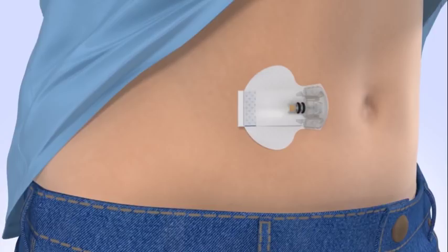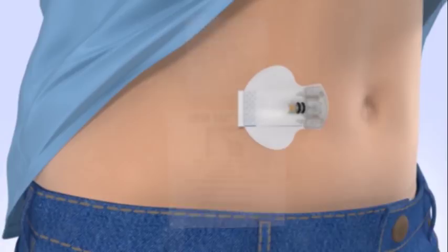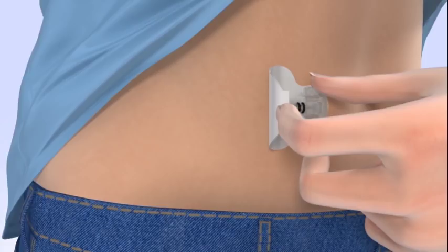Now that your sensor is inserted, you may wish to use an optional liquid adhesive, such as SkinTac, to help keep it in place. To apply, open the packet and remove the SkinTac wipe. With one hand, gently lift the adhesive pad while keeping your fingers on the sensor base to prevent it from pulling out.